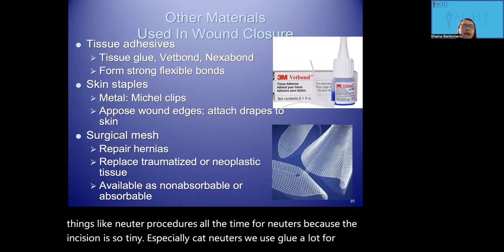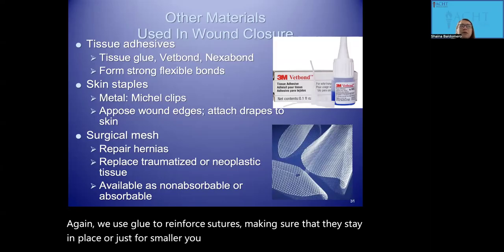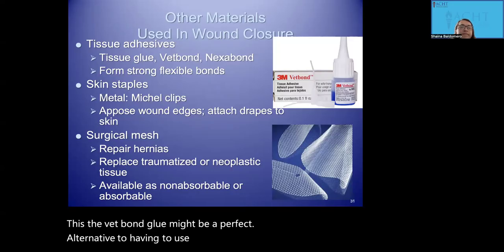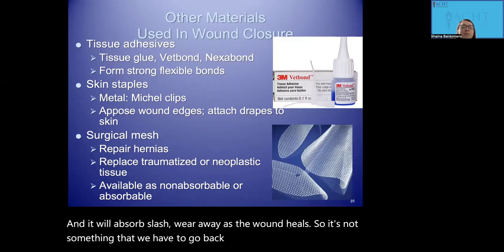Again, we use glue to reinforce sutures, making sure that they stay in place, or just for smaller procedures, if they're removing a little wart or a skin tag, the vet bond glue might be a perfect alternative to having to use sutures. And it will absorb or wear away as the wound heals. So it's not something that we have to go back through and remove.